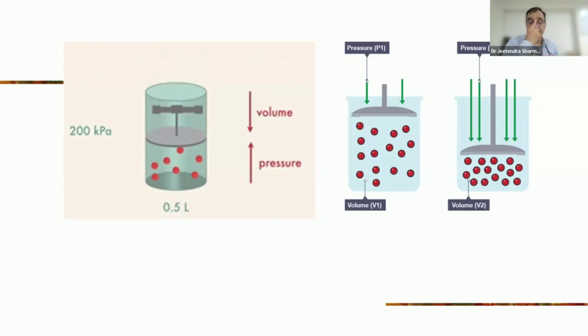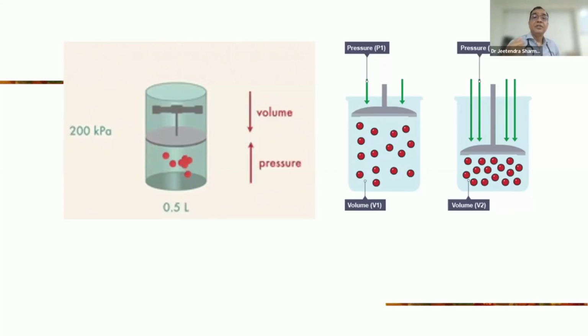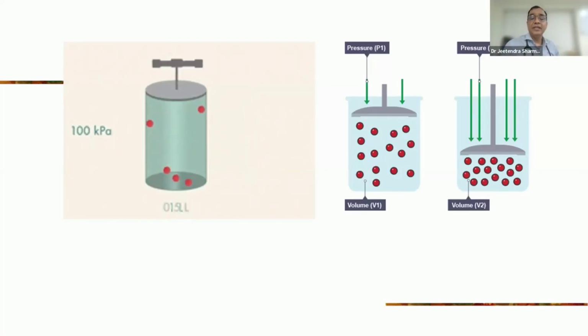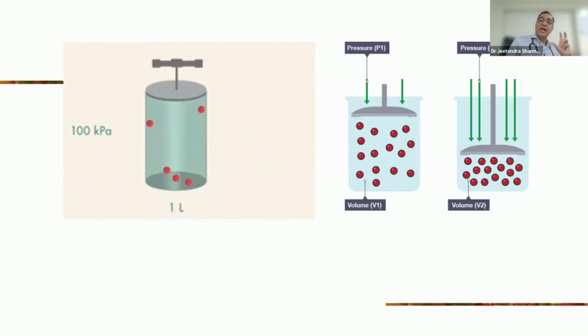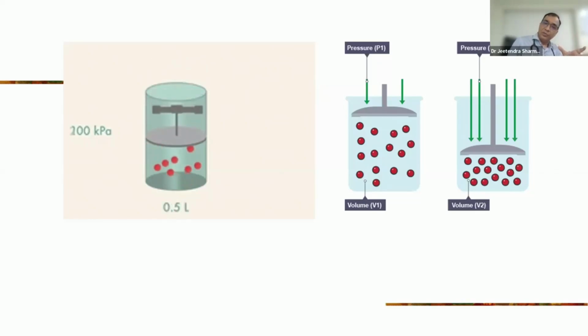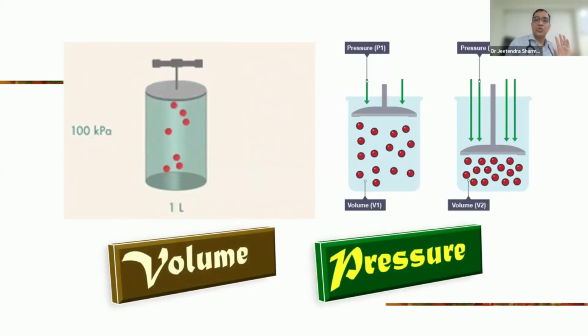Like when we fill the CNG in our motor vehicle, they don't measure in terms of volume. They just keep the pressure at a limit, and eventually later on they convert this pressure into volume. So at this moment, everybody is clear. Whenever we give the inspiration, either we give it in the form of volume preset or pressure preset. That is the basic understanding for the subsequent slides on modes of ventilation.